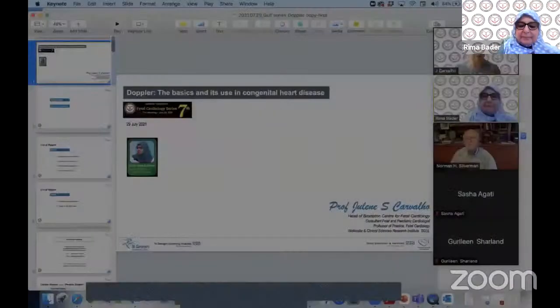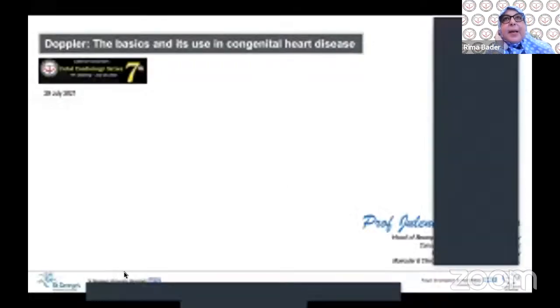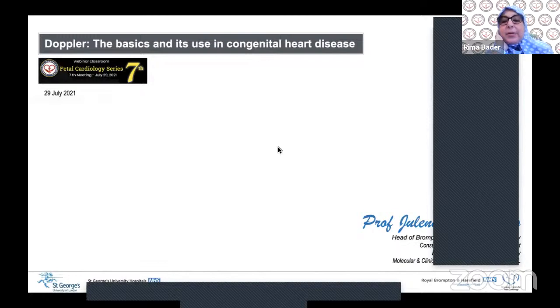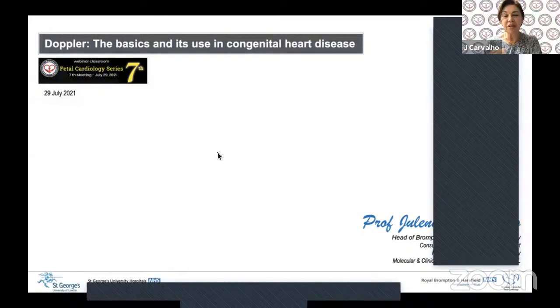Sorry. Hope you can see the first slide. Yes. Hello. Yes, I can see the screen, and as we said, we're going to talk on the basics, and then go a little bit on advanced on the fetal Doppler in this talk. Thank you so much. It seems to be cut off on the main screen. Yeah, sorry, I haven't moved yet because I wasn't sure that you could see my slides.